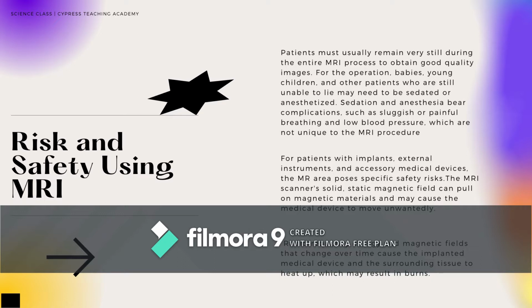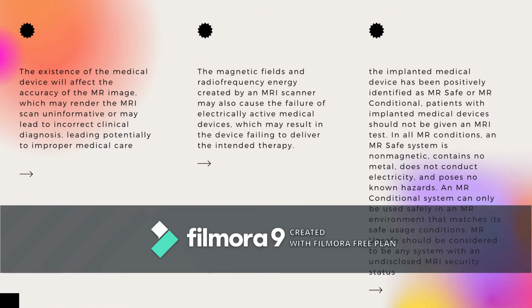For patients with implants, external instruments, and accessory medical devices, the MR area poses specific safety risks. The MRI scanner's solid static magnetic field can pull on magnetic materials and may cause the medical device to move unwantedly. Radio frequency energy and magnetic fields that change over time cause the implanted medical device and the surrounding tissue to heat up, which may result in burns.